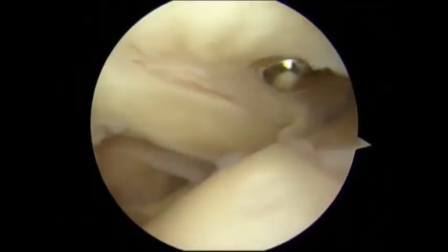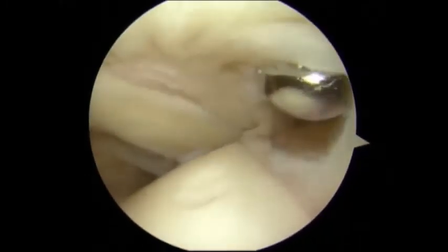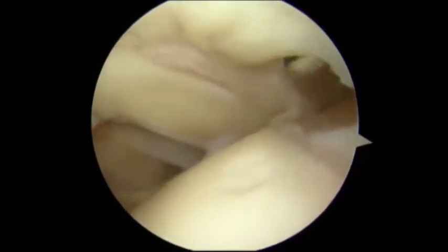The shoulder is viewed from the posterior portal. After preparation of the full thickness rotator cuff, the tendon is mobilized.